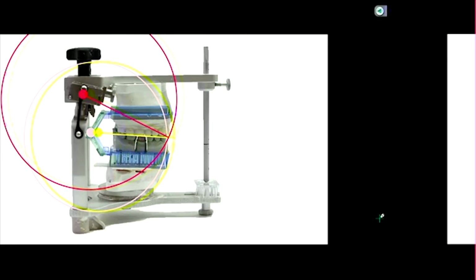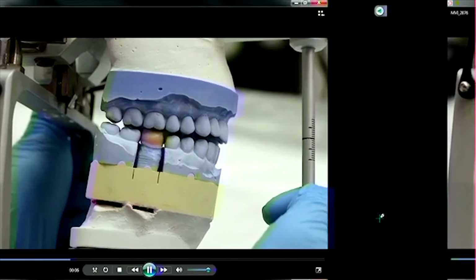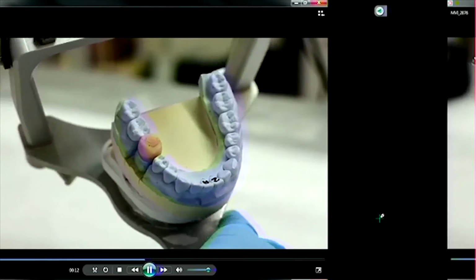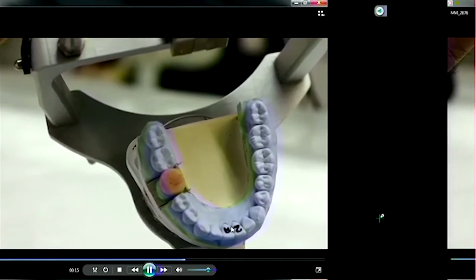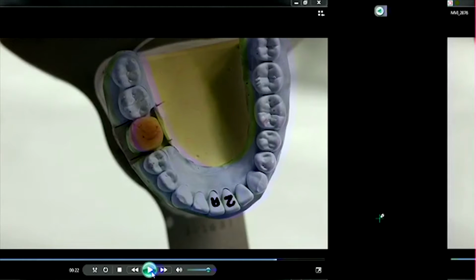So we'll start with the one mounted in the correct position. As we go in lateral movements, both working and non-working, what we'll show you is the... Not zoom in, but just focus. Make sure that's in focus right there. So you can see the little arrow, right? Okay, the next slide will have the picture a little bit more clearly.